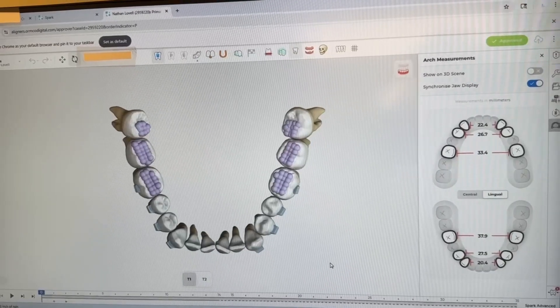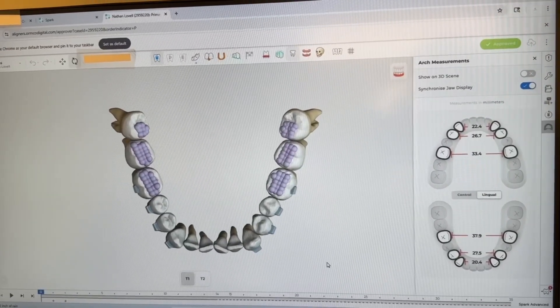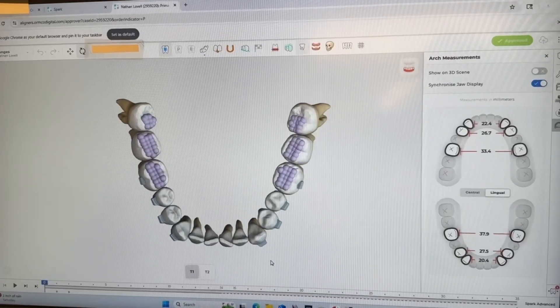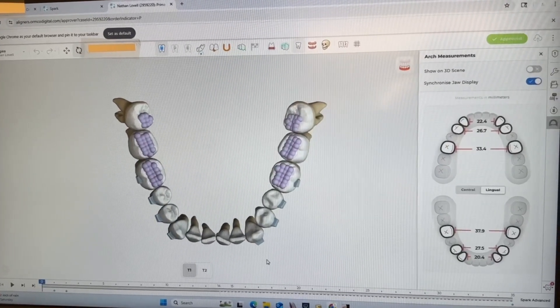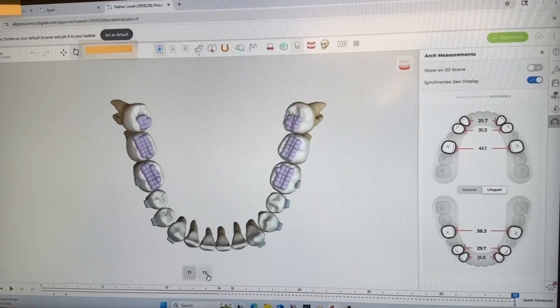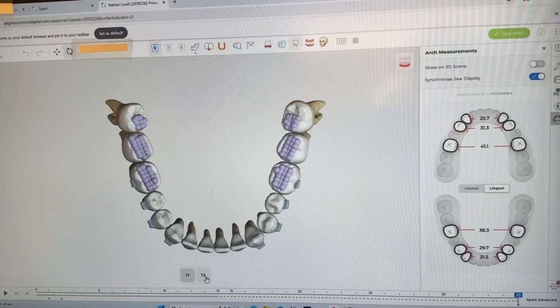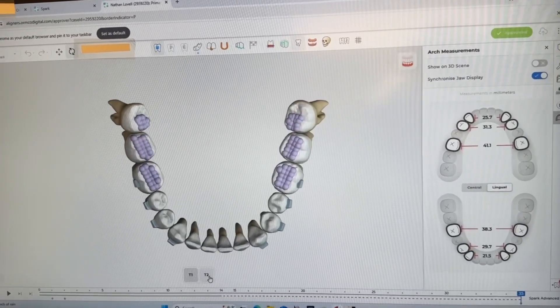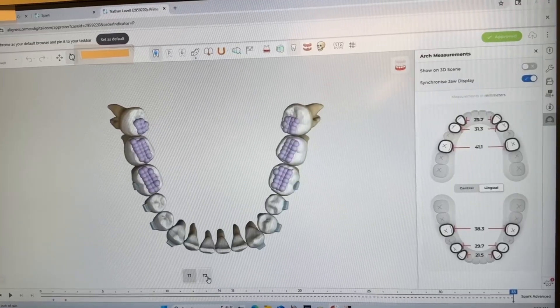We don't have a suture on the bottom, so we can't do conventional expansion. But what we can do is upright the teeth, reposition them, and get a little bit of alveolar expansion. With the uprighting and the alveolar expansion, we can get him to about 38.3 millimeters of intramolar width on the lower — so that's what we can achieve.